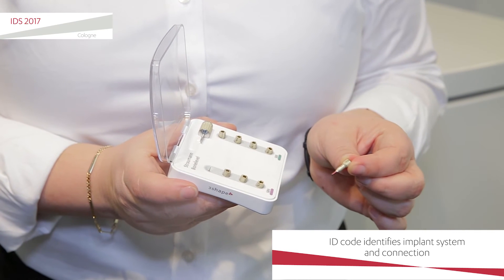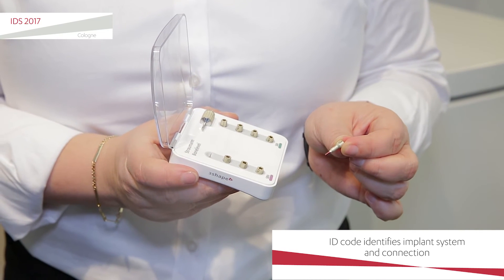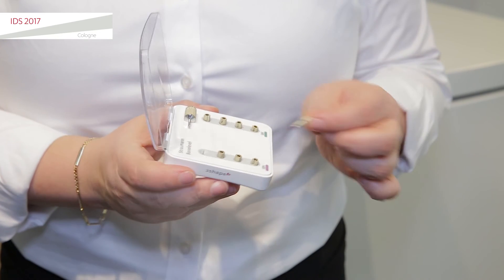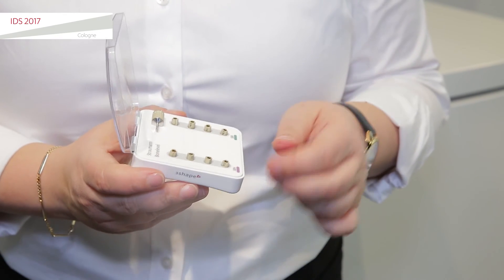What it does is it picks up the implant system and connection and transfers that automatically into the order form. So that's really cool — you have no more entering your details yourself, and no chance or risk of making errors in that. That's really cool, coming out later this year.